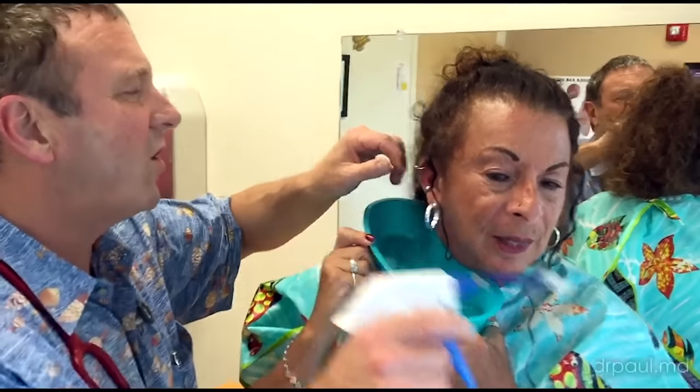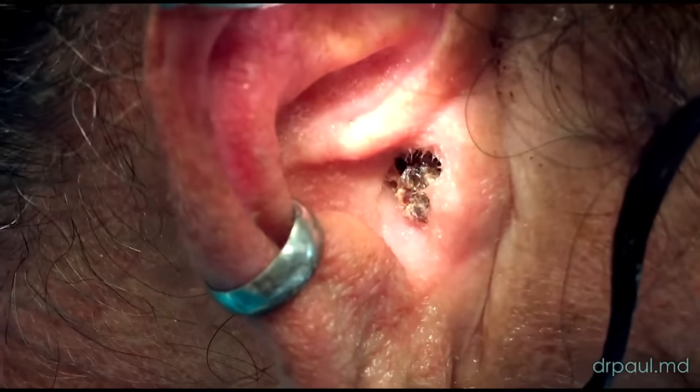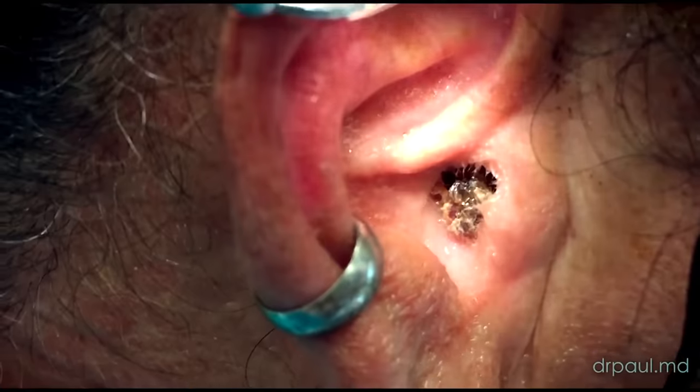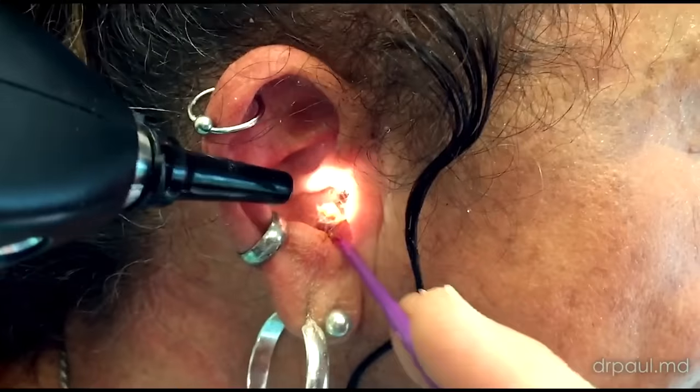That's starting to hurt, isn't it? Hold on, folks. Come over here with your camera. Sitting right at the canal. Got it? Okay. There it is. That was in your ear. Wow, yuck. Oh wait a minute, there's more. We got another whole huge chunk of wax. There it is.